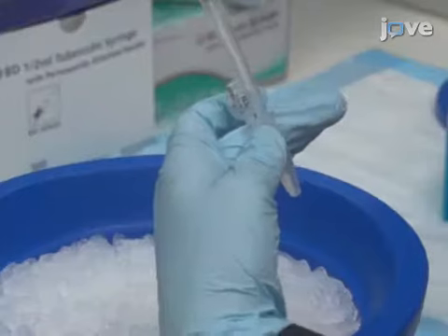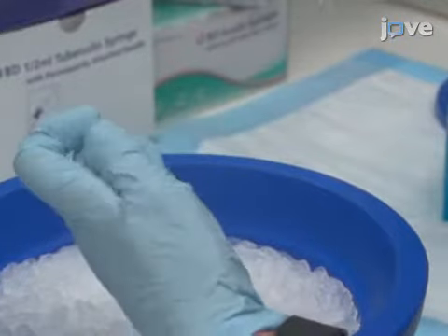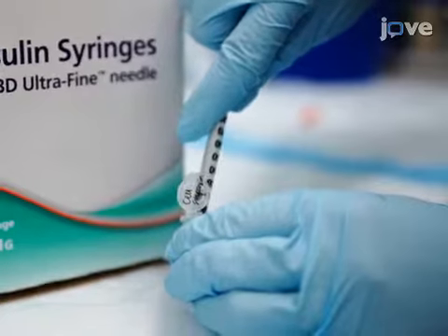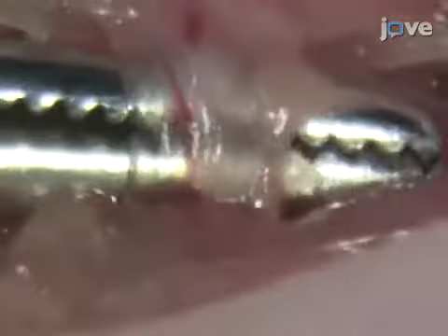When the vessels are ready, pipette the tumor cells up and down several times to re-suspend them into a single cell solution and to break up any clumps. Then, aspirate 100 microliters of cells per mouse into a 31-gauge insulin syringe. Now, slide the angled forceps back under the vessels using the suture as a guide and open the forceps so that the vessels rest gently on the tips.